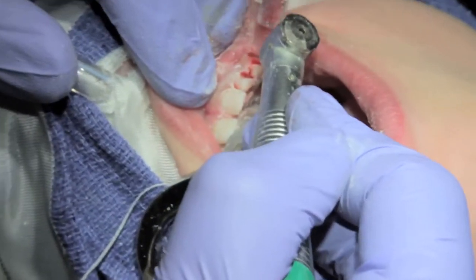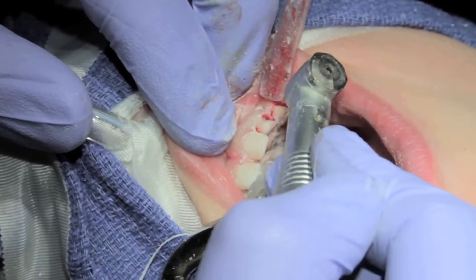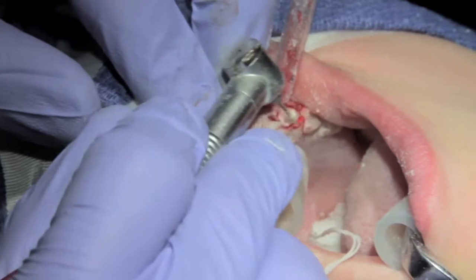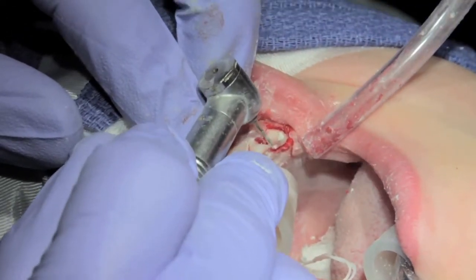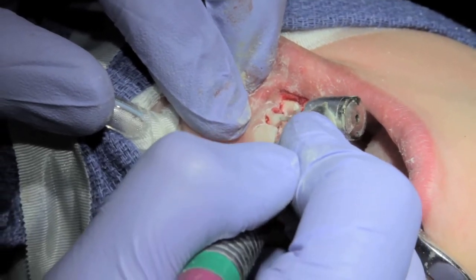As you can see, as you take away more tooth structure it becomes more uniform and covered, which denotes that you're getting to a healthy layer of tooth and no longer have decay. You want solid tooth structure. Then bevel the lingual again, and make sure there are no sharp angles anywhere. Then come in and do your pulpotomy access.